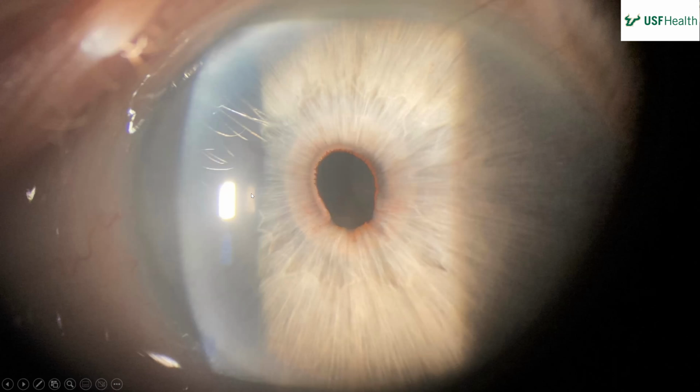Why don't you do the next one? This is hard to photograph. There you go, that's kind of the finding. Okay, so this is the retroillumination, and you can see some atrophy superiorly. Okay, good.